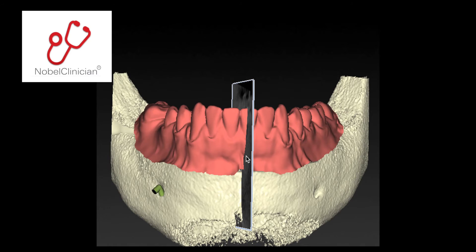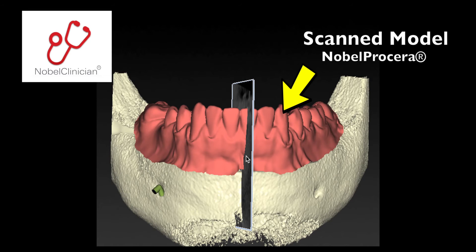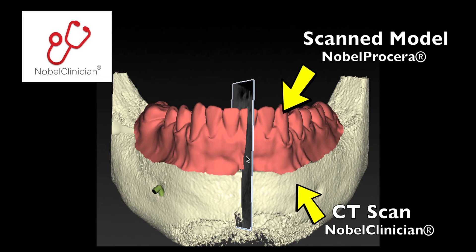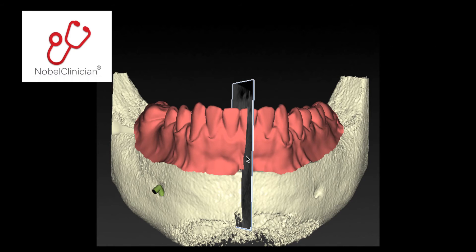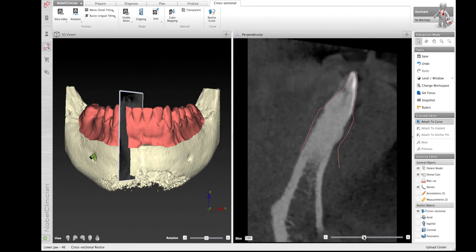During this CT planning session we're going to use Nobel Clinician software to do what's called a smart fusion. A smart fusion is a blend of a scanned model into a CT model so the two being put together allows you to see soft tissues, where tooth position is, and more importantly you can then fabricate a guide template so that you're able to position the implant in the exact position for depth and angulation.